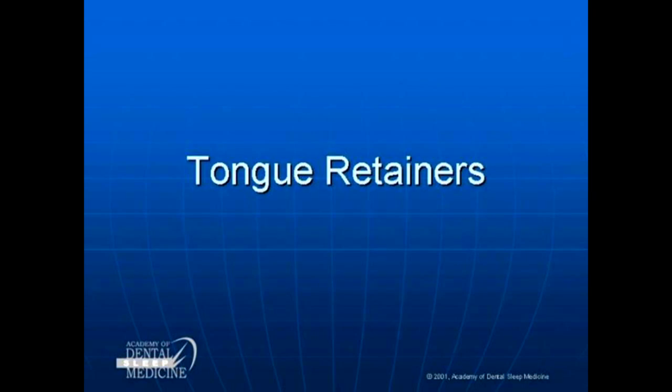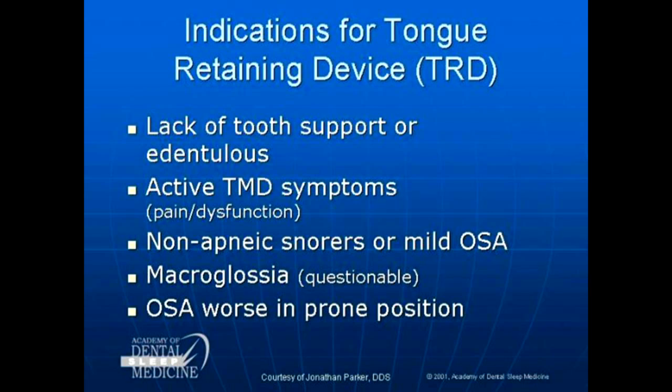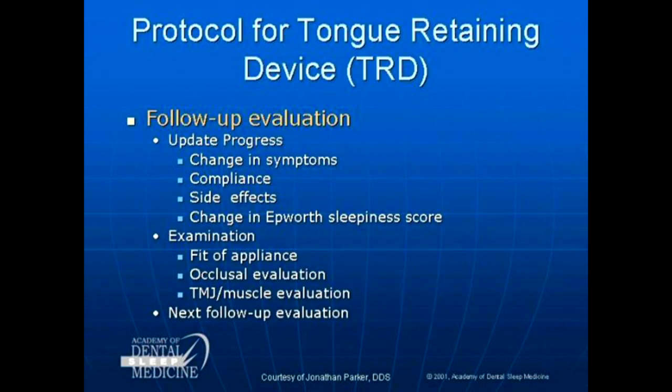Tongue retainers. If you don't have tooth support, they're edentulous. If you have active TMD symptoms and you can't move the jaw forward. If they have mild OSA and they can't tolerate one of the other appliances. With a super large tongue, it may help it stay in the tongue retaining device better, but it's questionable whether it's really being used. I'd have several of these around. At least it's something to offer a patient. If the obstructive sleep apnea is worse in the prone position, then you may try one of these tongue retaining devices. You've got to keep an eye on them, check up, see how the patient's doing.